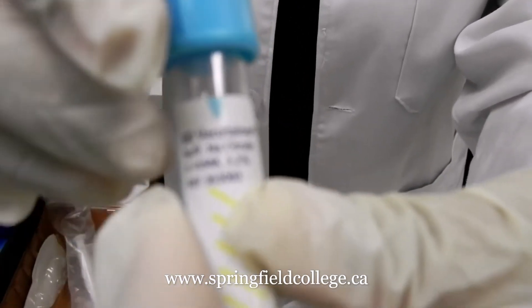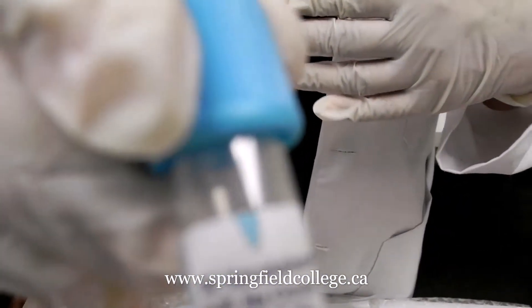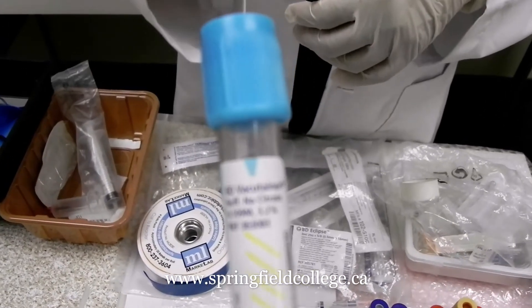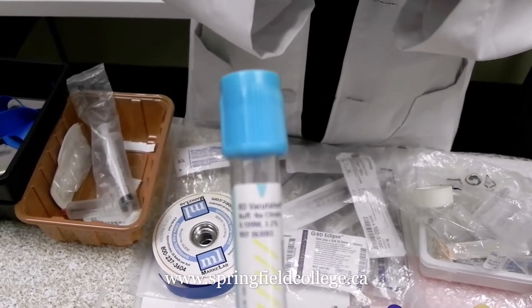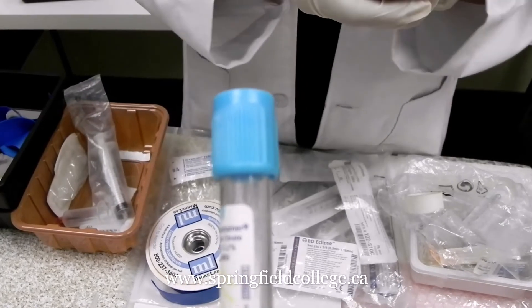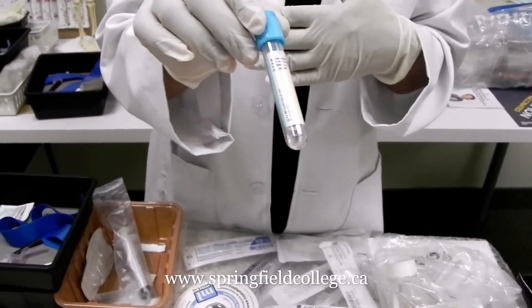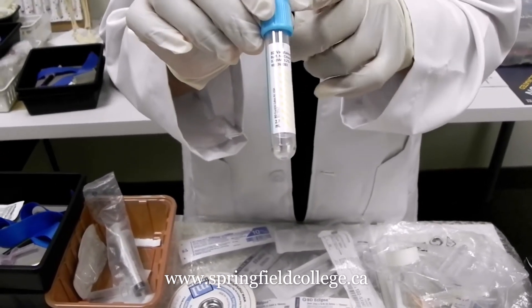The good thing about all the tubes is there is never over-filling. But if you don't take care properly, then it would be under-filling. If it is under-filled and the tube is having an additive, your results may be changed. So always be careful to fill the tube up to the marked level. The first tube, as per the order of draw especially for multiple tube collection, is the light blue sodium citrate tube.